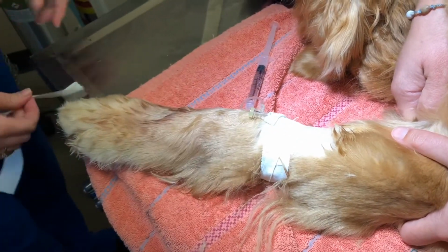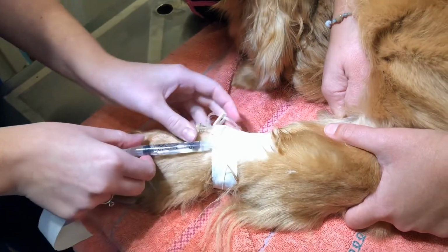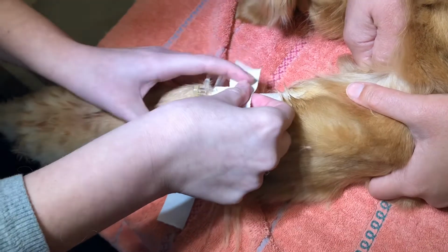And the final piece of tape is a big piece of tape, and that will wrap the T-set across and secure that.